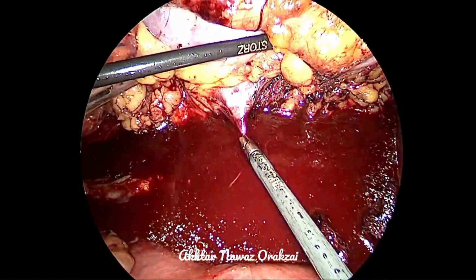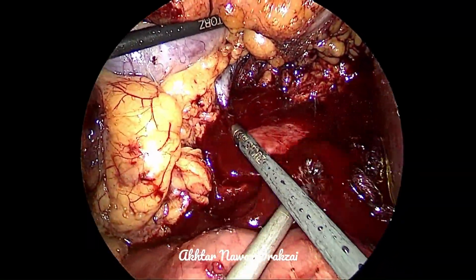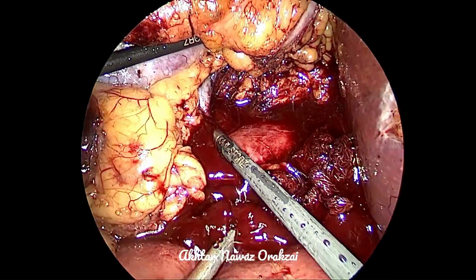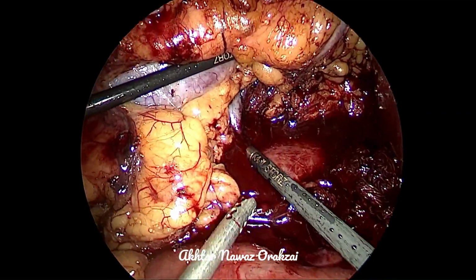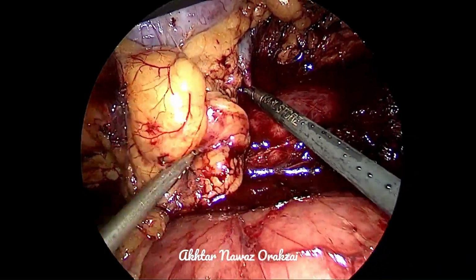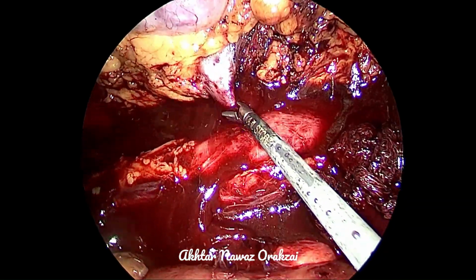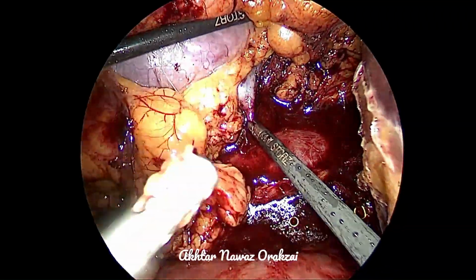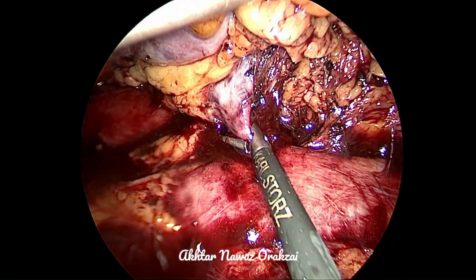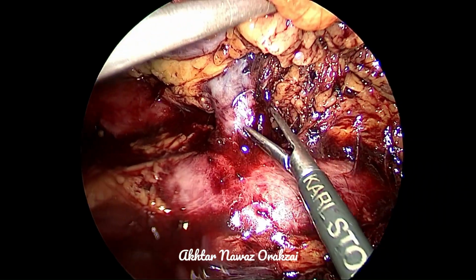prongs, so that it can cover the whole wall, and then a quick suction of the field so as to make the vision better and to see the structures better. And also, in the meanwhile, while sucking all this blood and clots, we need to think, what is our plan?